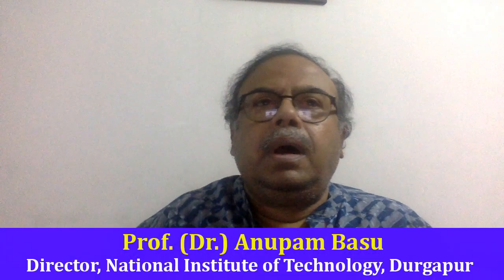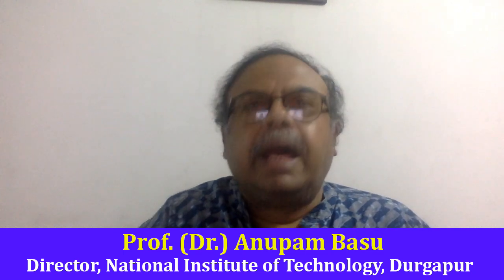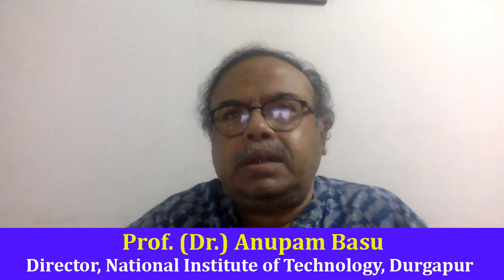Now, coming to the particular topic that we are supposed to discuss, at NIT Durgapur we have tried to develop a low-cost oxygen concentrator. Why is that needed? Even when COVID was not there, a lot of people who suffer from respiratory problems, COPDs, and other pulmonary disorders often need to be supplemented by an external supply of oxygen.